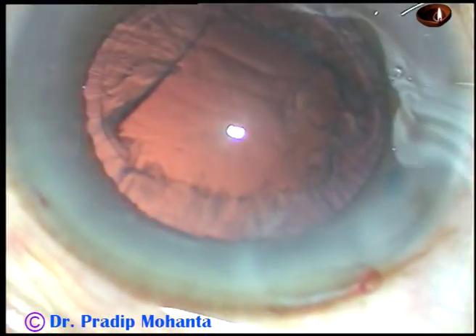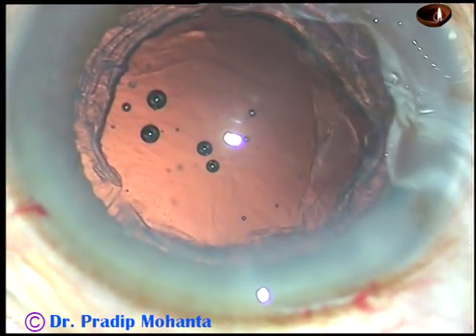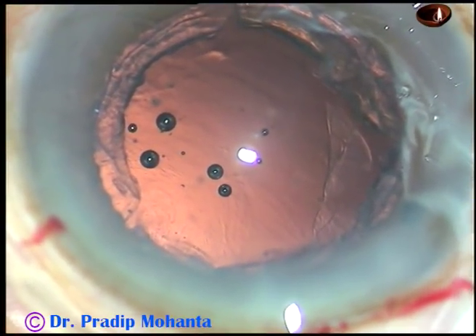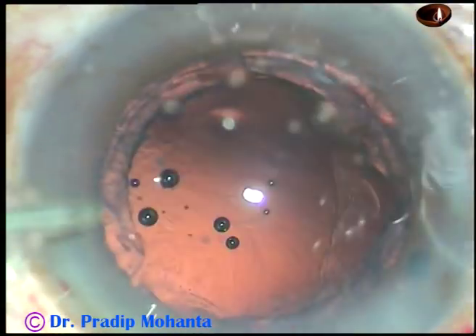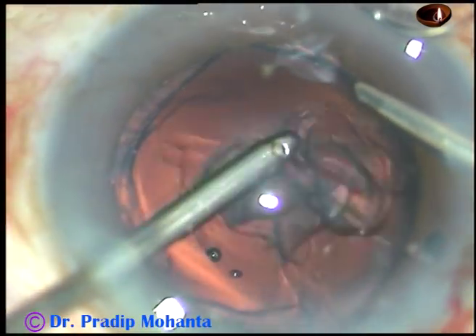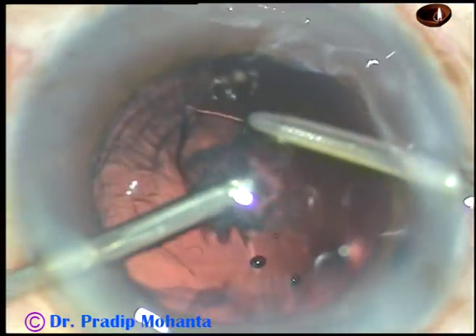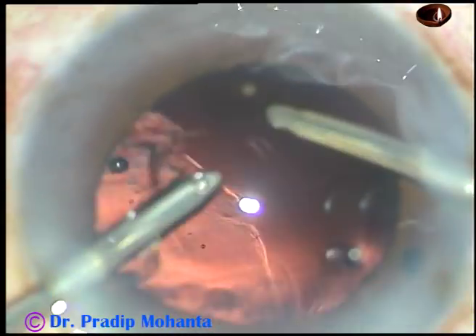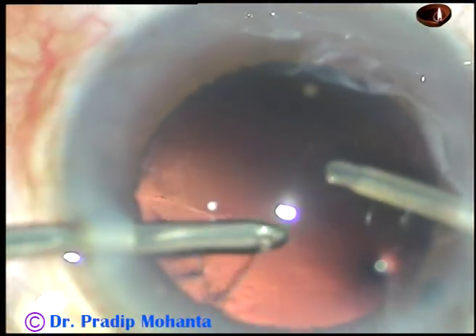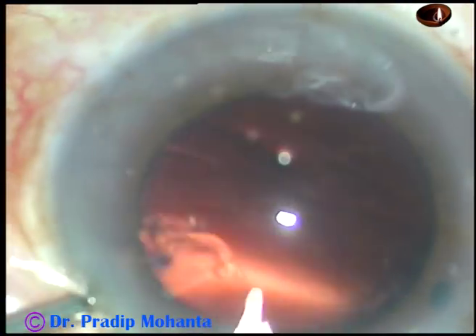We can see a lot of cortical matter remaining. Inject visco. And in this case, I am going to use bimanual irrigation aspiration. It is not at all difficult to use bimanual irrigation aspiration. The irrigation is through the right side port, aspiration through the left. I have started aspirating the cortical matter. See how quickly and nicely you can remove the cortex with bimanual irrigation aspiration. Most of the cortical matter has been removed; only a bit of cortex remains sub-incisionally at two o'clock.